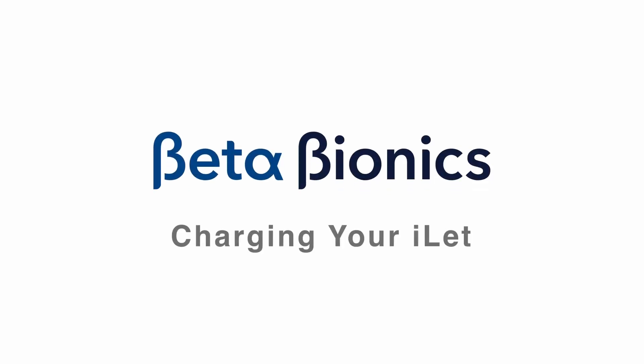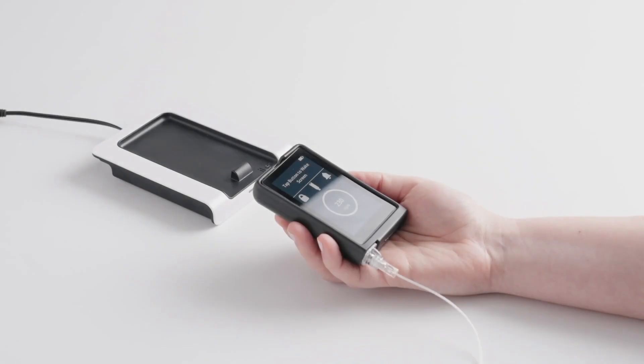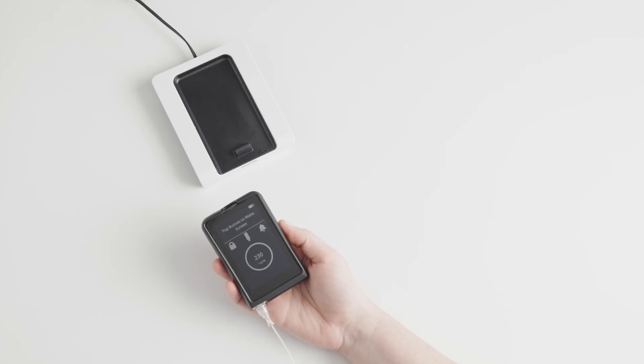Your eyelet has a rechargeable battery inside. You can charge your eyelet using the Beta Bionics wireless charging pad. To charge your eyelet, first connect the included wireless charging pad to the power adapter with the micro-USB cable and plug it into an electric outlet.